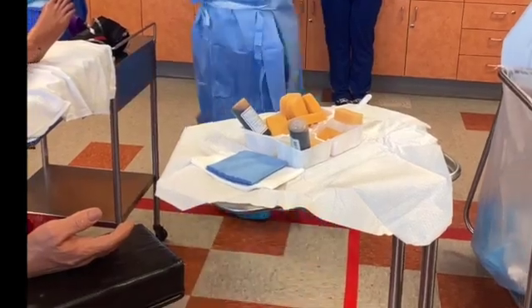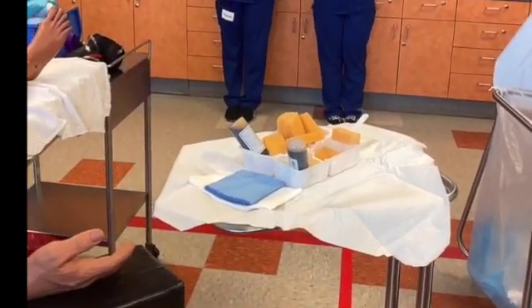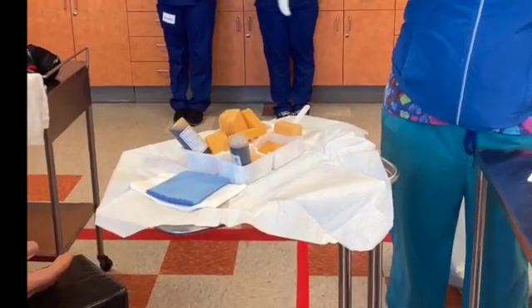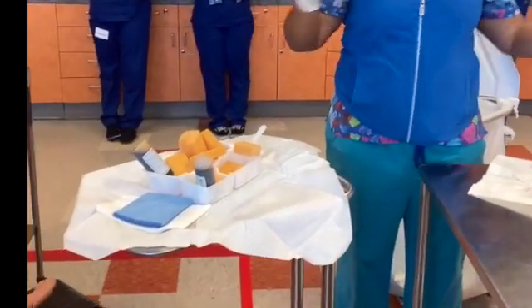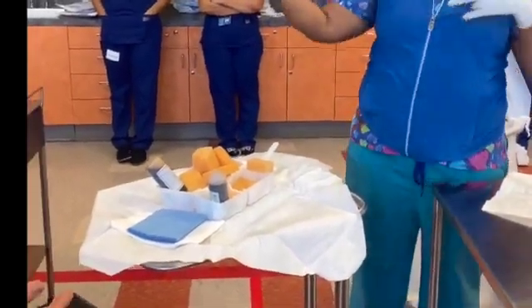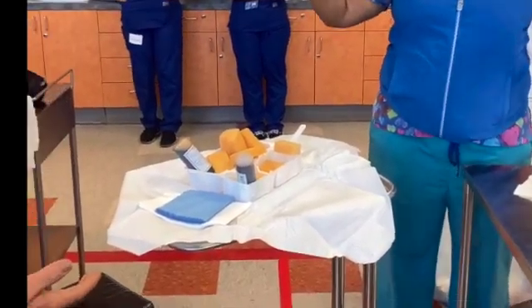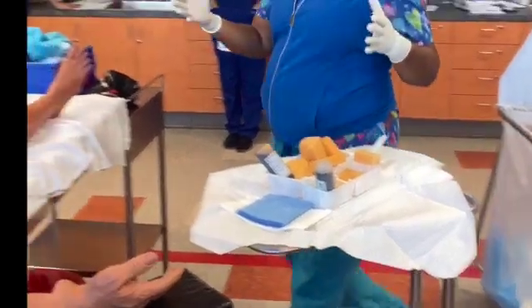I'm sorry, you're the scrub. No, I'm a circulator. So the scrub, this is teamwork. The scrub can always get your prep ready for you while you're doing other stuff. But it's all about communication. I'm cool with it. I'm like, thank you. Because then now I'm like, cool, I'm ready, thank you.